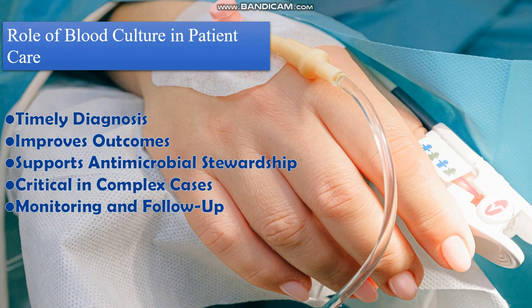In addition to that, blood cultures are the cornerstone of antimicrobial stewardship programs. They help clinicians select the right antibiotic and avoid unnecessary treatment that contributes to the growing problem of antimicrobial resistance. Blood cultures are especially critical in complex cases, such as infections in immunocompromised patients or when dealing with polymicrobial infections. They provide critical insights that guide clinical decisions in these challenging scenarios.